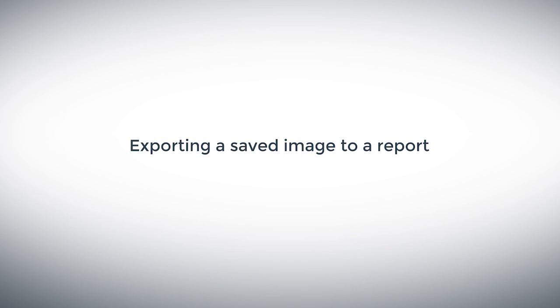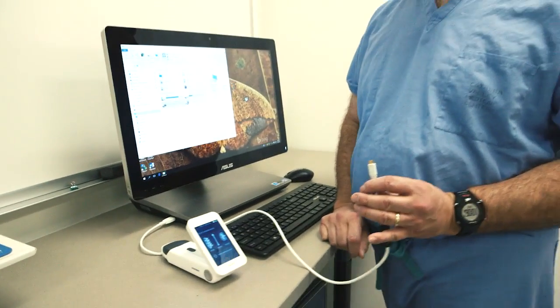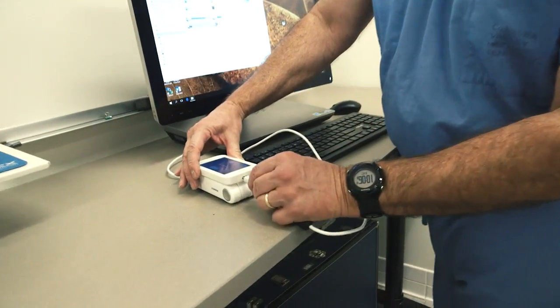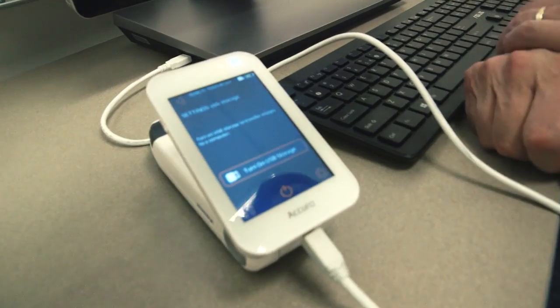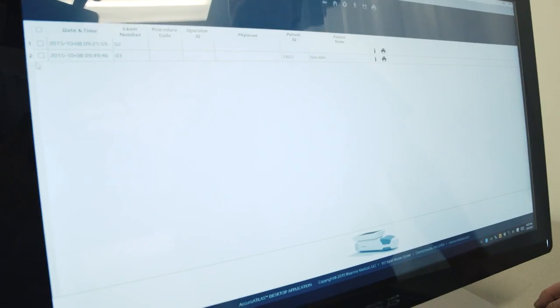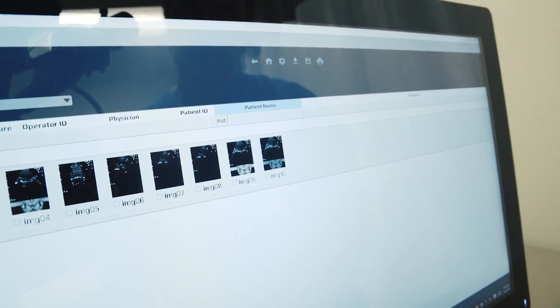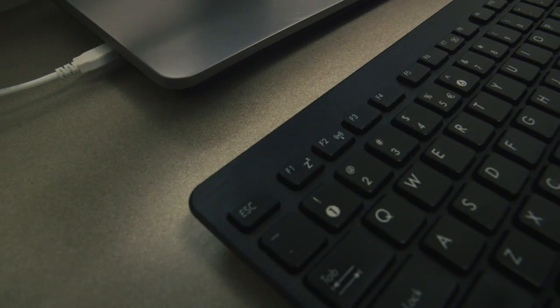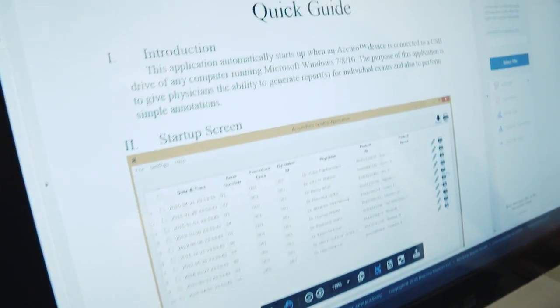A saved image can be exported to a report by first connecting the Acuro to a Windows computer using the micro USB to USB cable provided. On the Acuro, from the home screen select the settings button, then select USB storage and press the turn on USB storage button. The Acuro Atlas program will auto-run on the Windows computer. From the Acuro Atlas home screen, locate the exam of interest — clicking the icons to the right will generate a report. The Acuro Atlas software provides various options to edit patient information and customize the report. A quick start guide can be accessed by pressing F1 or navigating to the help documentation menu.